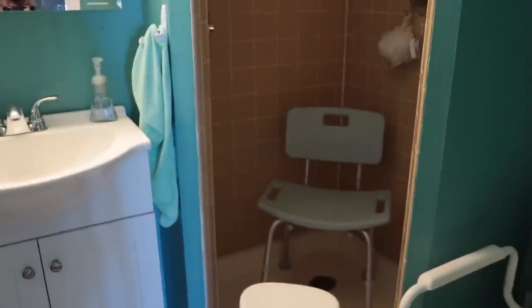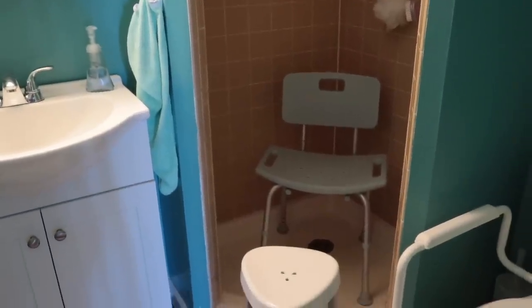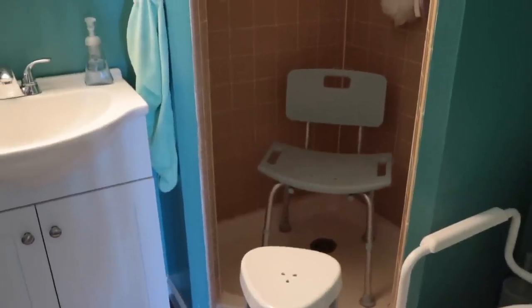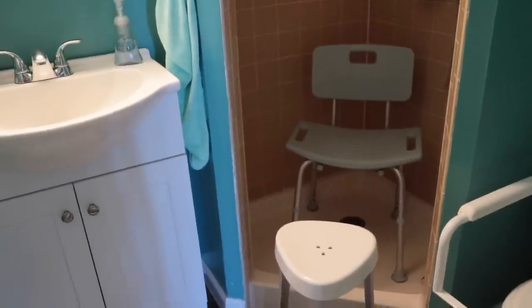In the shower we did have a shower chair, which is kind of vital for any new amputee or amputees in general. There are also shower benches if you have a tub setup, but the shower isn't going to be very conducive for that setup.